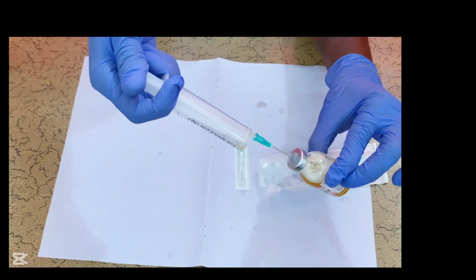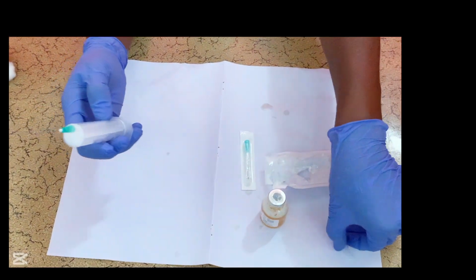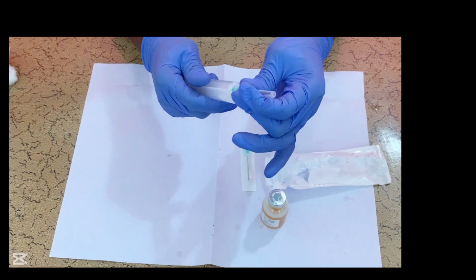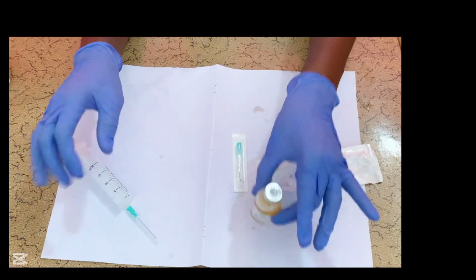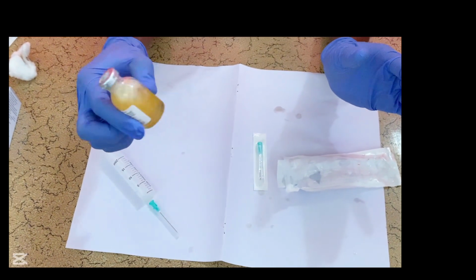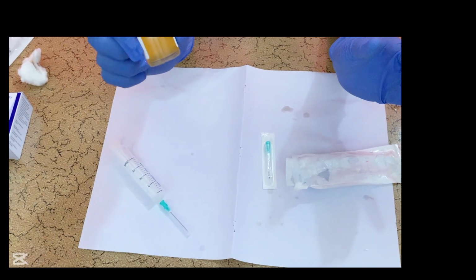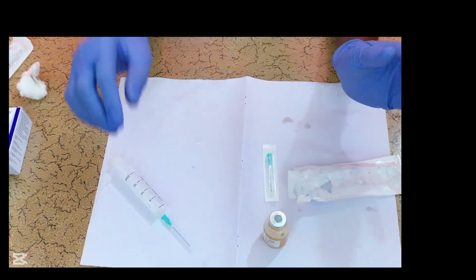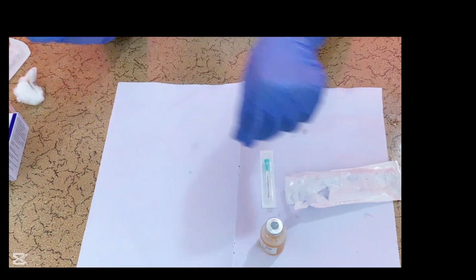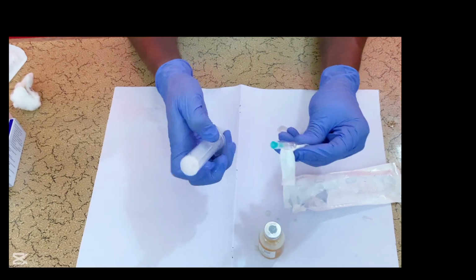Then you remove the needle from the vial. Then you allow it to settle for some time. Then you put back the cap of the needle to maintain the sterility of the drug. Then you shake it gently. So make sure you shake the vial gently to make sure that all the drug is completely dissolved. Then you change the needle. Now this is how you are going to withdraw the drug from the vial.